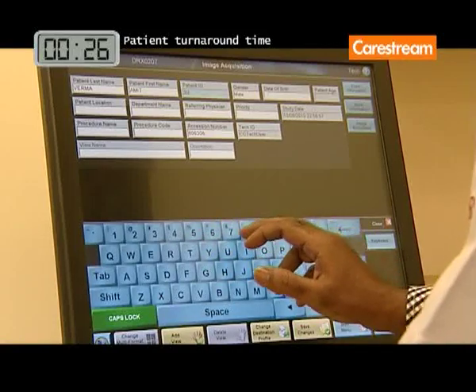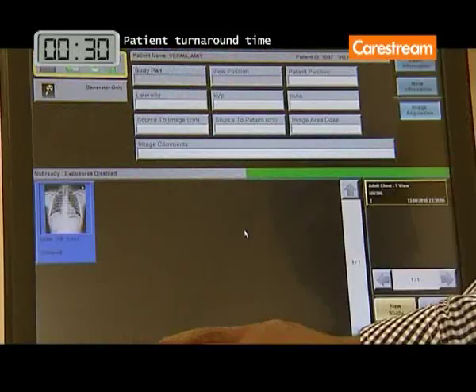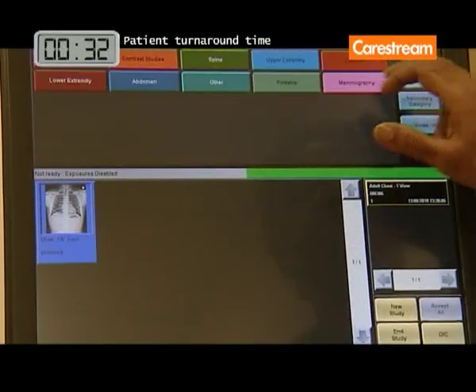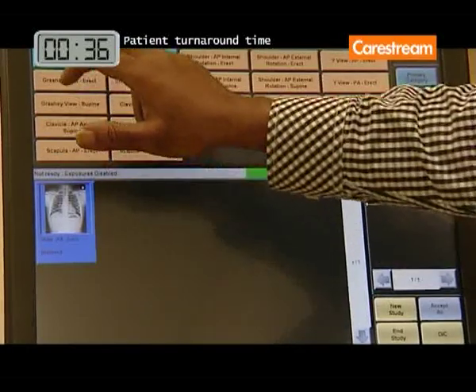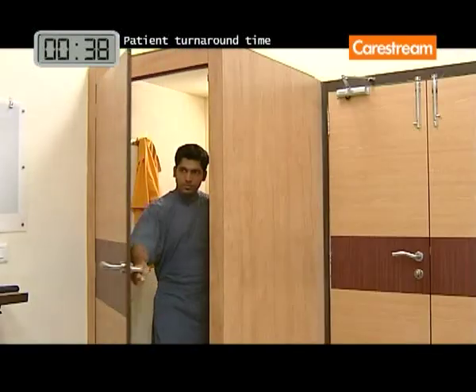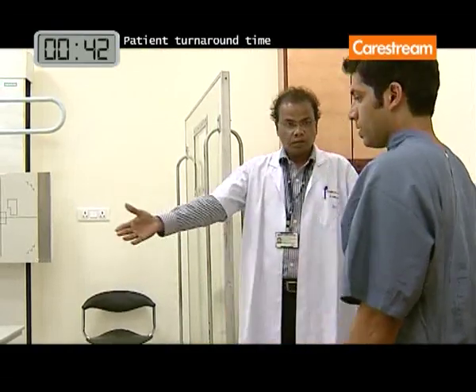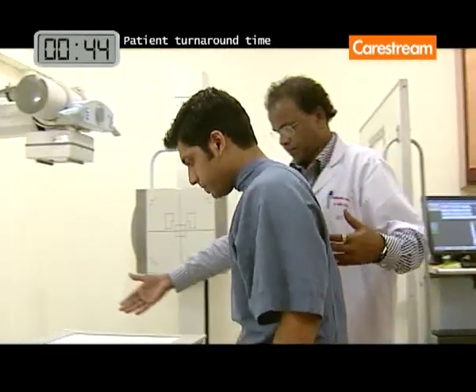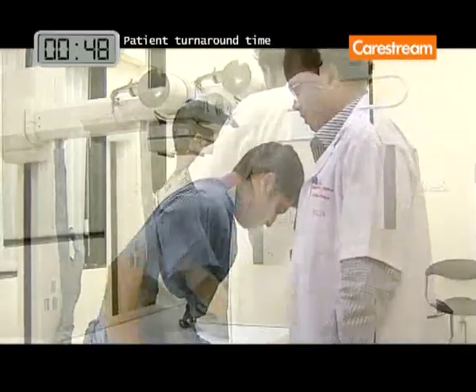The DRX-1 system capture console simplifies user operation with the same intuitive touchscreen user interface available in CareStream CR systems. The DRX-1 system provides fast and easy upgrade for existing X-ray rooms or mobile units.